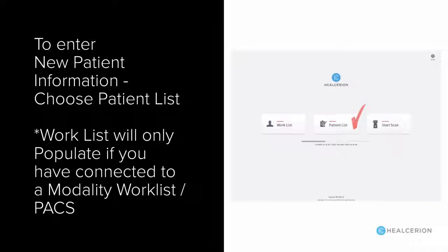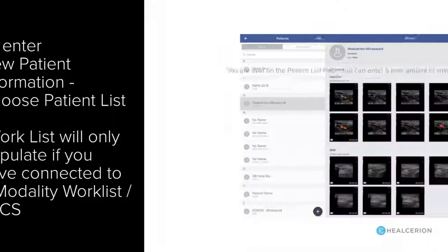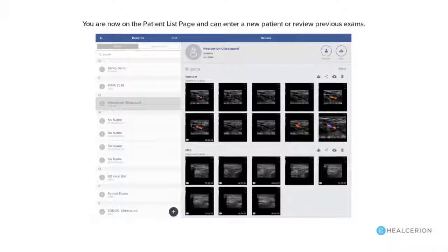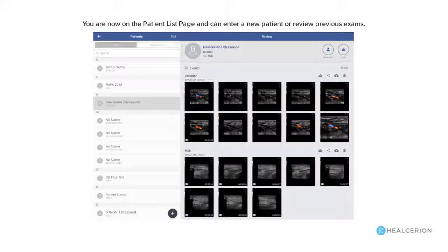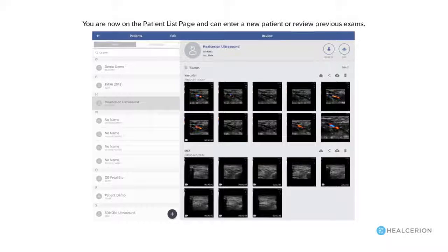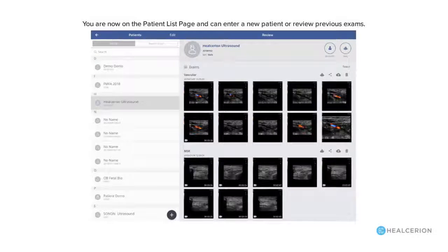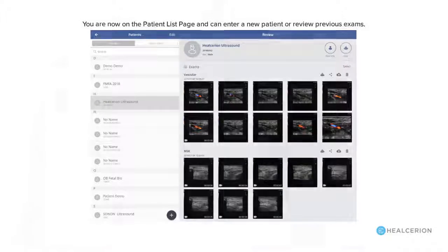From the home page you can start a new exam by going to patient list. The patient list page archives all of the exams you've already done, and you can use the plus sign to create a new patient file.